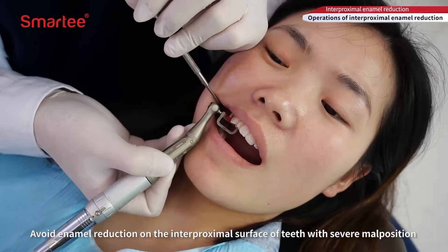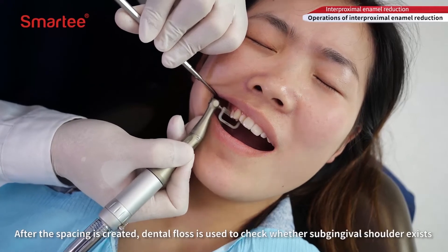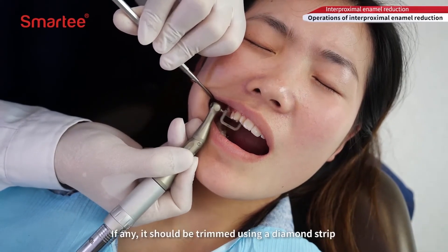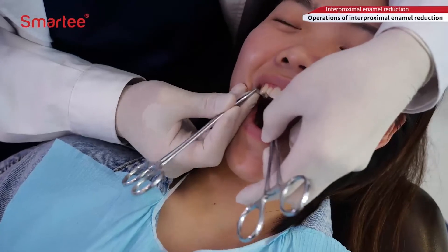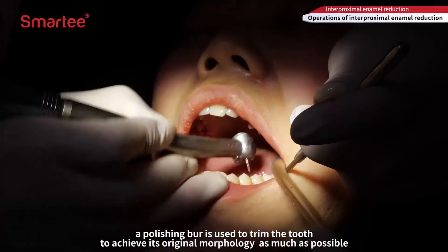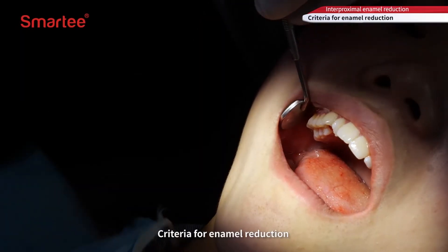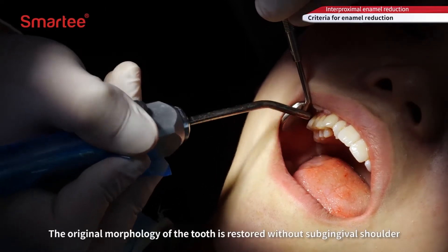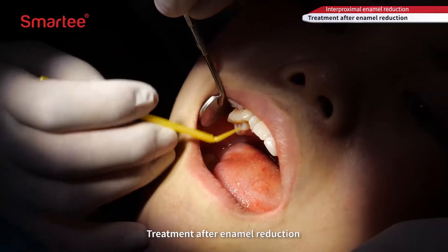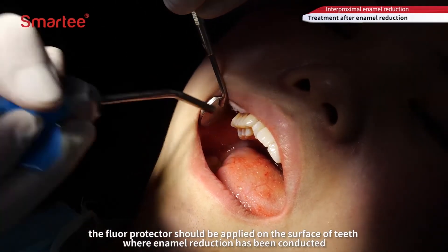Avoid enamel reduction on the interproximal surface of teeth with severe malposition. After the spacing is created, dental floss is used to check whether a subgingival shoulder exists; if any, it should be trimmed using a diamond strip. After the amount of enamel reduction meets the specified requirements, a polishing bur is used to trim the tooth to achieve its original morphology. After enamel reduction, the fluor protector should be applied on the surface of teeth where enamel reduction has been conducted, and oral health education should be provided to prevent caries.